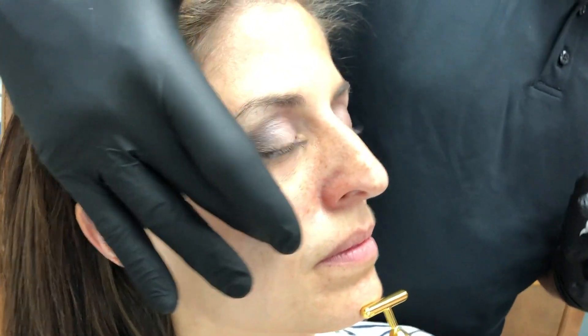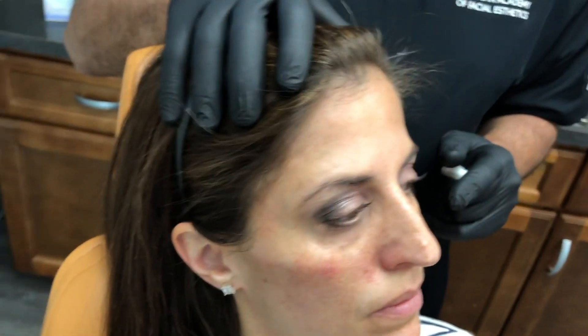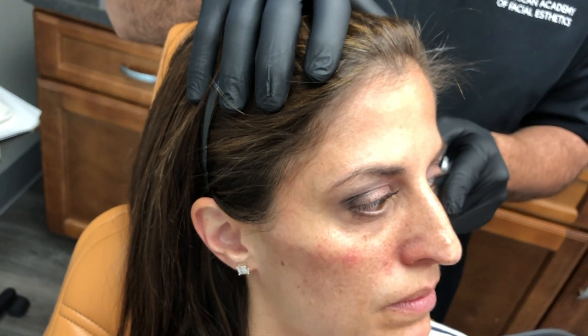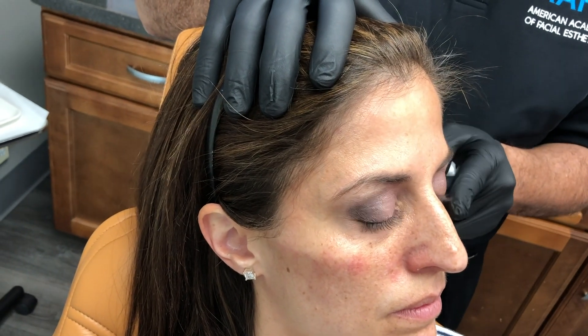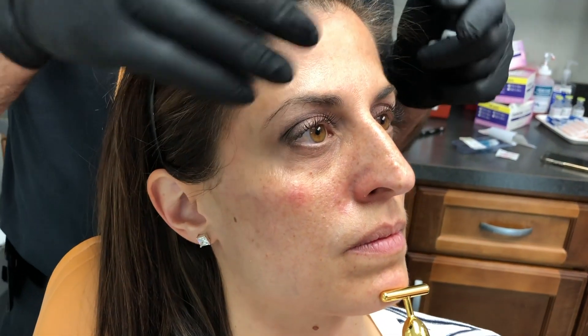Take a look — here's that OG curve. See where you can get the camera on my finger — this is that OG curve that is really just beautiful that we've created here. Look at that OG curve — that is really beautiful. When you take someone who's had no or very little mid-face volume and give them some, it makes the world of difference. Now take a look straight on and you can see that heart-shaped face really start to happen because these masters have gone in and we've brought these cheeks out.